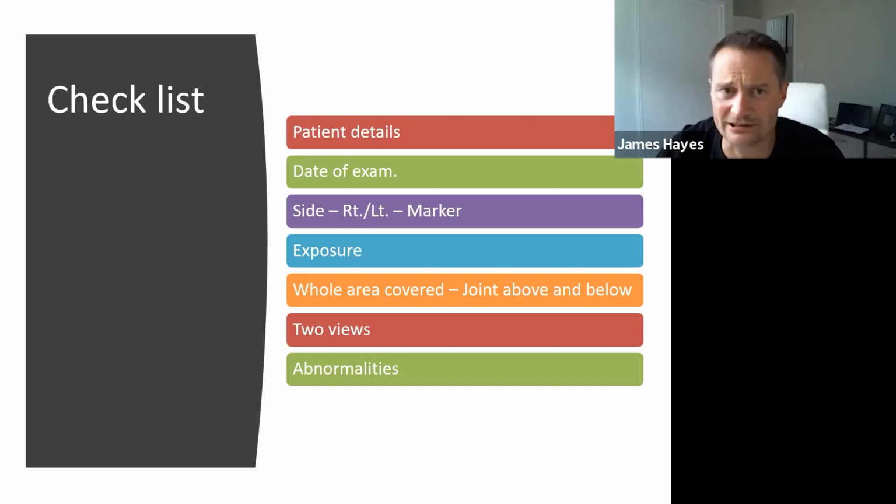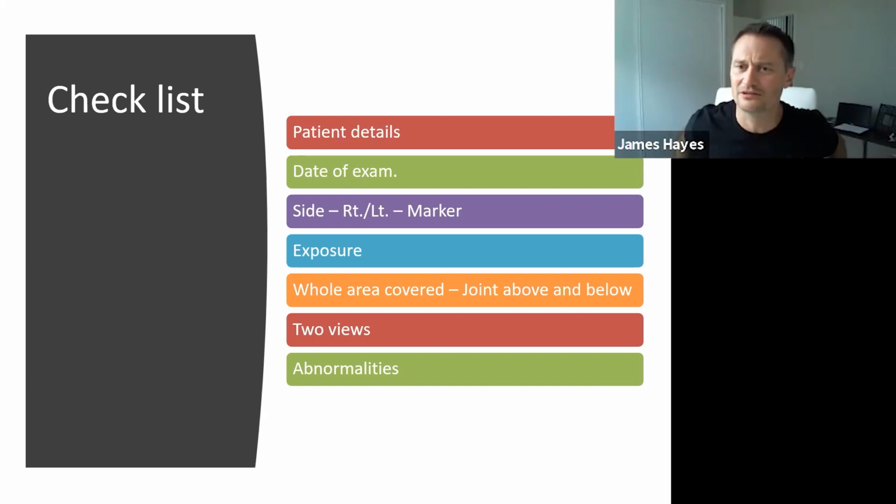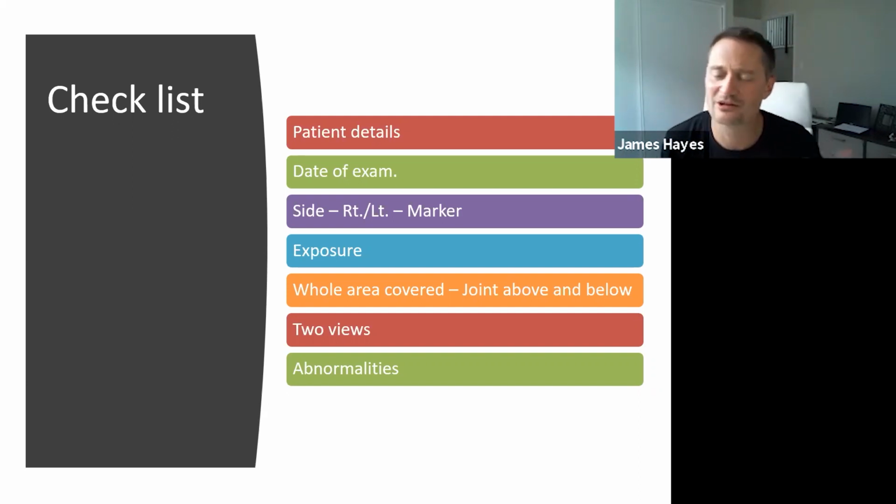Now, if you work in ICU, I didn't get the list of all of your areas you work in, but if you work in ICU, it's not just the date you're going to be looking for, but it's going to be the date and time, because, you know, you guys are working, far be it from me to try and tell you what you do, but you're working in 10-minute sections sometimes with patients recovering.